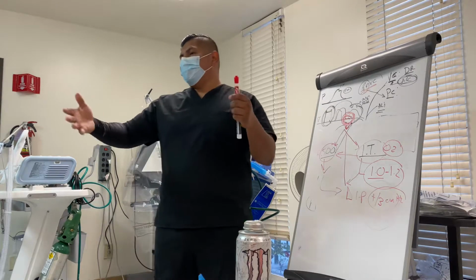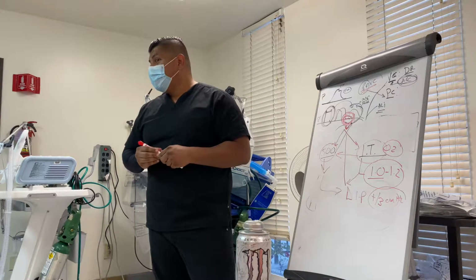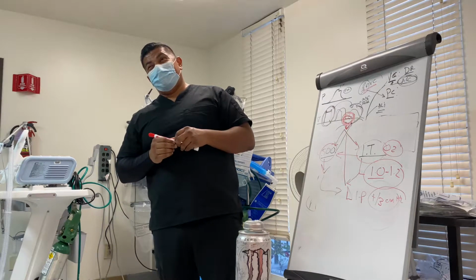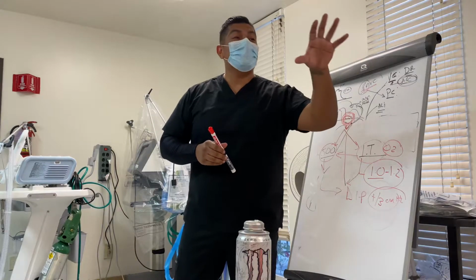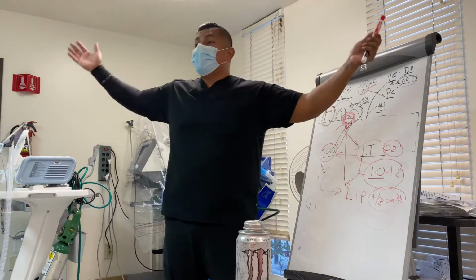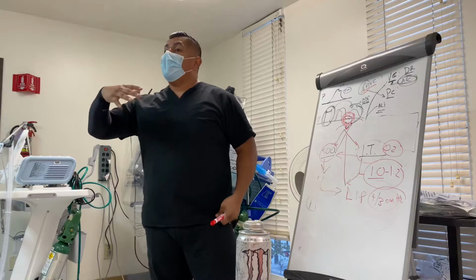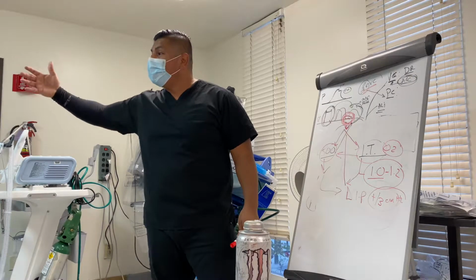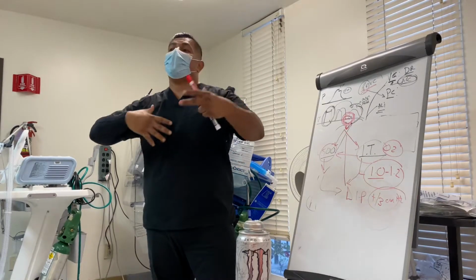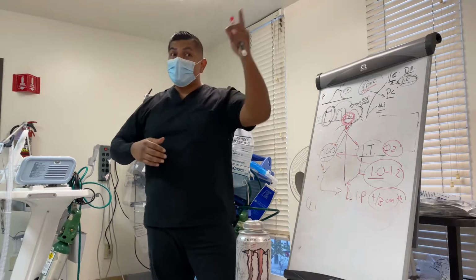It's kind of like when you have a blood gas. What's the worst kind of blood gas that you might have? Respiratory or metabolic acidosis? Well, metabolic. You're chasing something you can't control, and you're trying to compensate with CO2, which you can only do for so long. Same thing with this I time. If you are trying to chase that underlying demon of sepsis or some sort of hypoxia or anemia that's causing this patient to become tachypnic, you need to fix that patient.